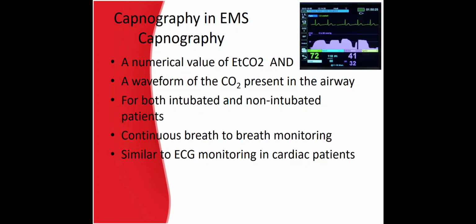Capnography gives the clinician a numerical value of the end-tidal CO2 and a waveform of the CO2 present in the airway. It can be used for both intubated and non-intubated patients. Capnography provides continuous breath-to-breath monitoring similar to a continuous ECG monitoring in cardiac patients.